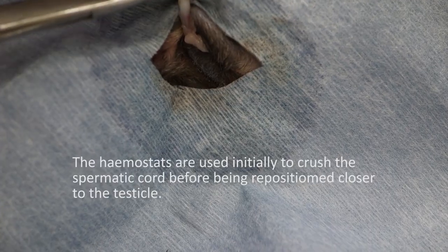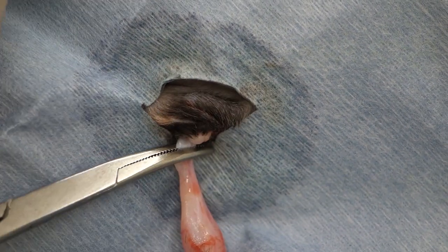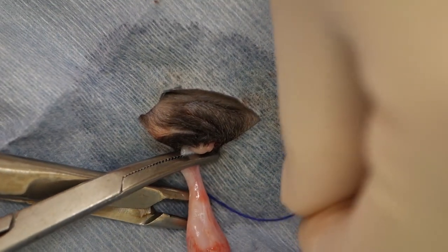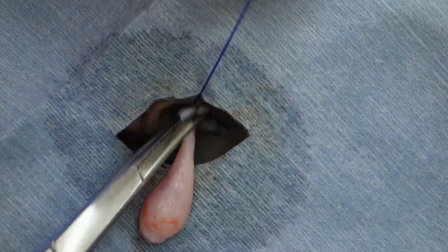We're getting rid of the little bit of fatty tissue that surrounds the spermatic cord. In older cats, we may have a little bit more fat than what we've got here. Again, we're crushing the spermatic cord and applying the haemostat, then ligating with four square knots using absorbable suture material.